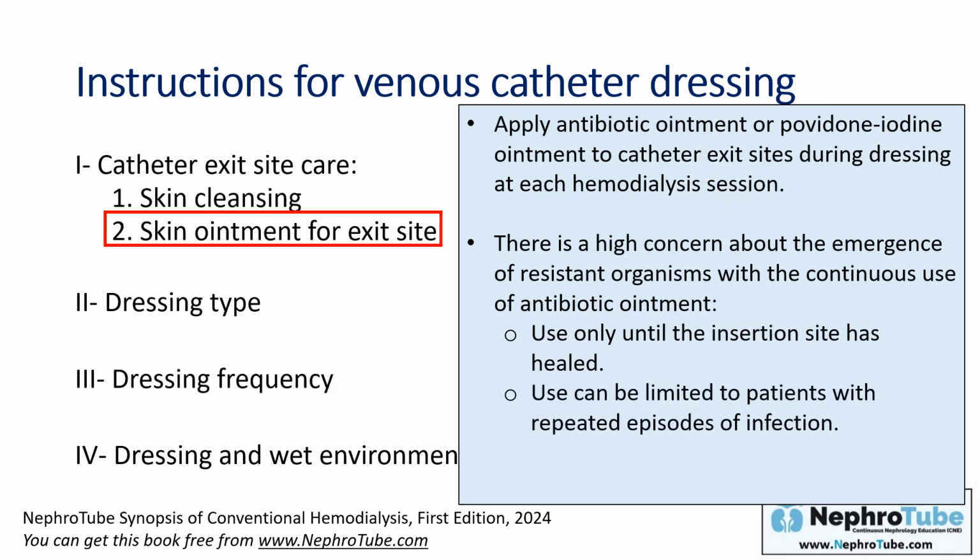Another intermediate strategy suggested that the use of the antibiotic ointment can be limited to patients with repeated episodes of infection. So there is no recommendation to use the ointment forever, but these are intermediate strategies to prevent and avoid resistance.